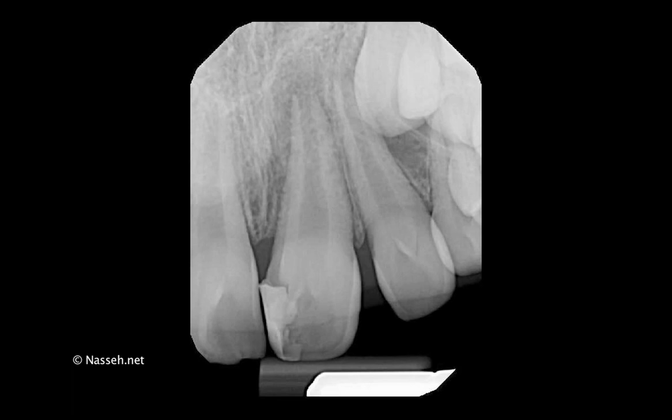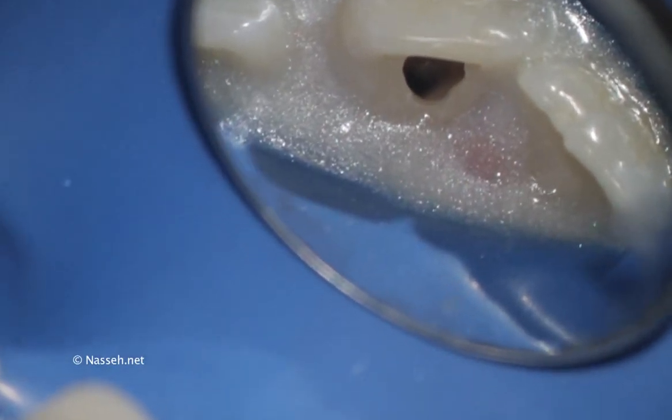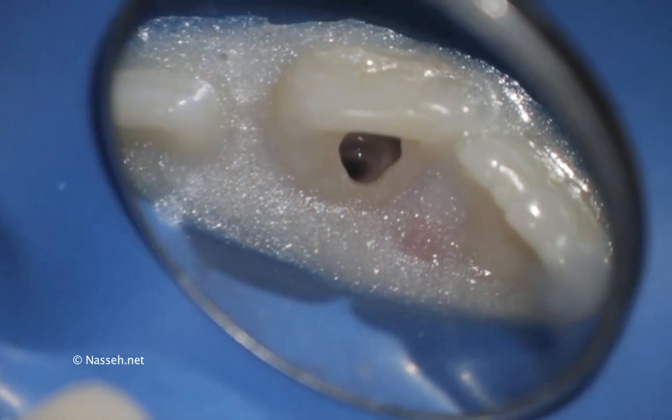There is a large area at the apex of this tooth. Apexification traditionally used to be done with calcium hydroxide treatment for multiple visits and it could take up to a year to form an osteoid. Today, with the use of putty and bioceramic root repair material, this procedure can be done in a single visit.